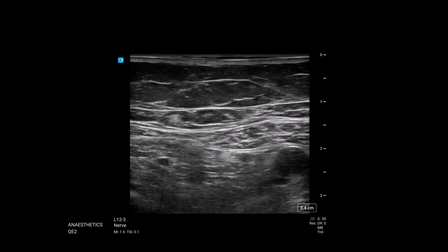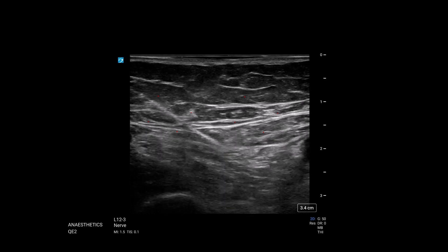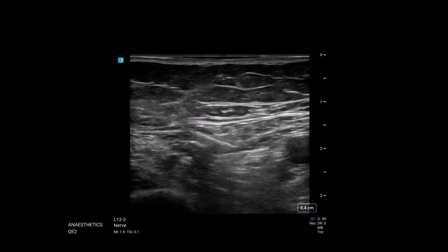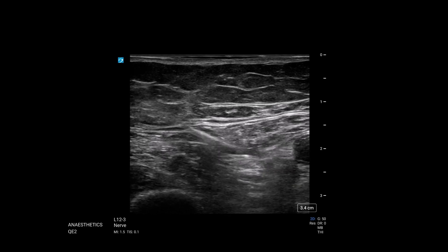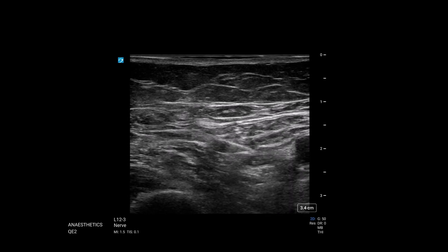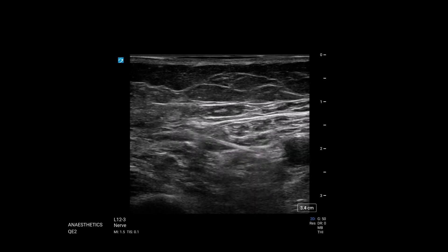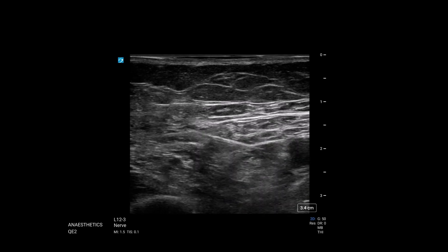Now we scoop the probe back across and we're looking for a landing zone for the block. We don't want to damage the cutaneous nerves — they're up here — and we want to find the saphenous nerve and the nerve to vastus medialis. Nerve to vastus medialis is somewhere in here, and that's what we're trying to open up now. So we're going between vastus medialis and sartorius, doing a few injections and seeing what we're getting. There's a sense there's nerve there. We do some hydrodissection — we can say that this is probably nerve tissue here and the saphenous is becoming more prominent. You could probably just inject a whole bunch of local, particularly after that redirect, and call it a day and cover everything.